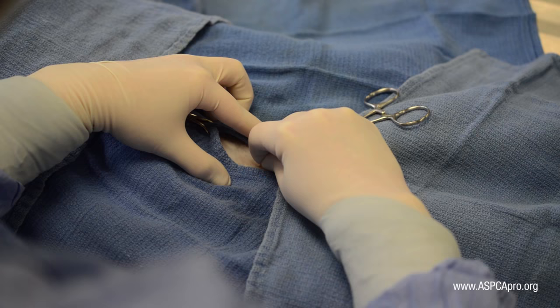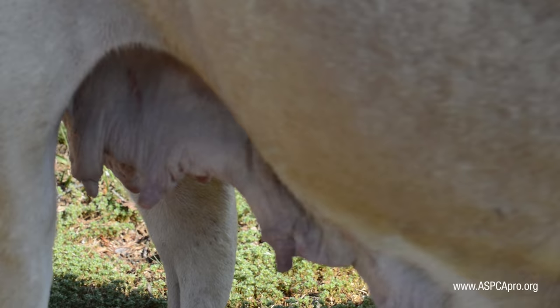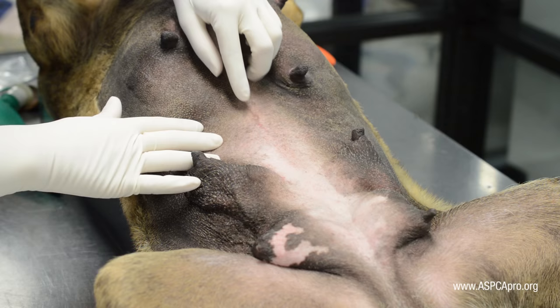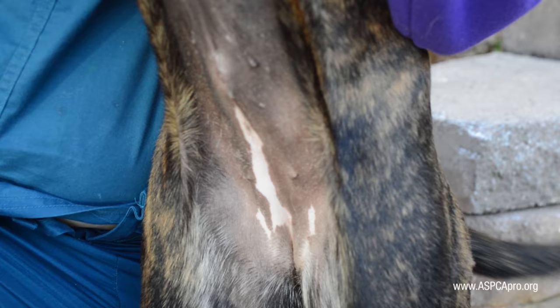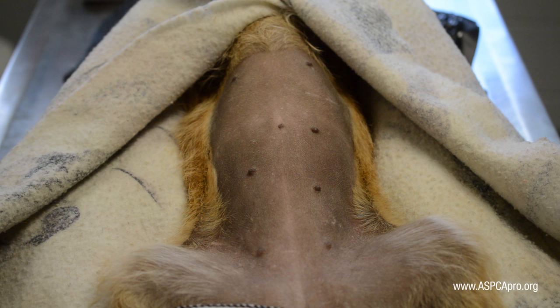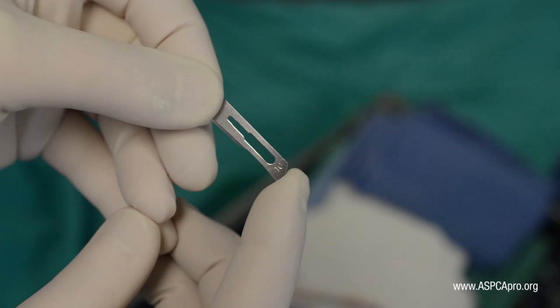Incision placement is the crucial first step in safely minimizing incision length for a patient. For dogs that are more than 18 months old and have either been through several heats or have had a litter, the incision has started just caudal to the umbilicus. For dogs 6 to 18 months old that have minimal nipple development, the incision is started one scalpel blade caudal to the umbilicus.